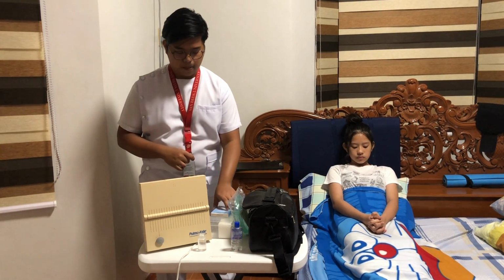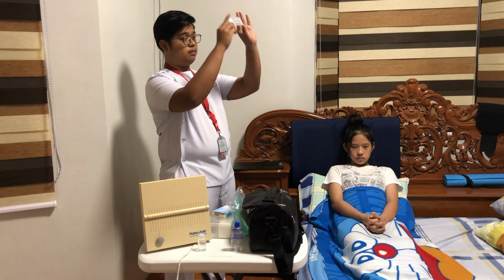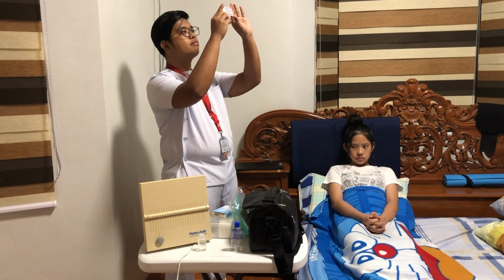And then afterwards, we need to visually inspect our solution for any particles, discoloration, or any loss of integrity. And we need to keep in mind not to administer the medication if the integrity is compromised. So we're going to check the solution if there is any presence of particles or discoloration. So in this case, our medication is in good condition, so we can now proceed.